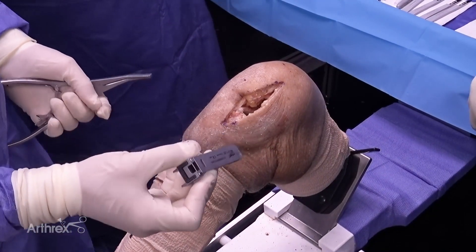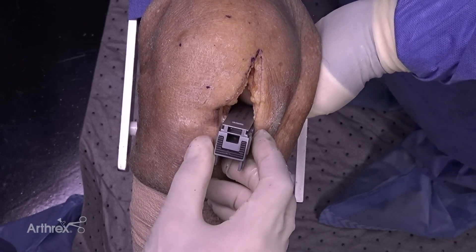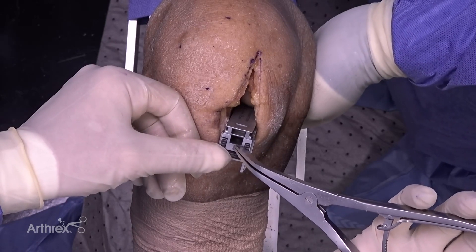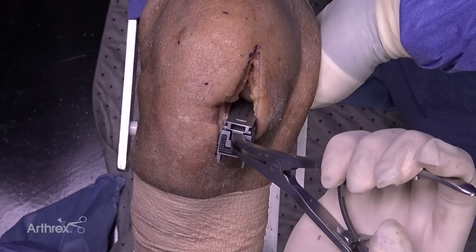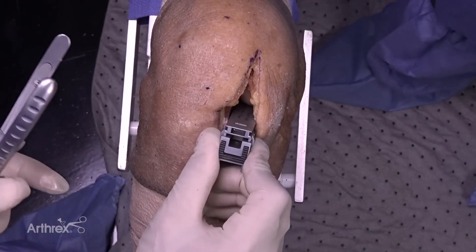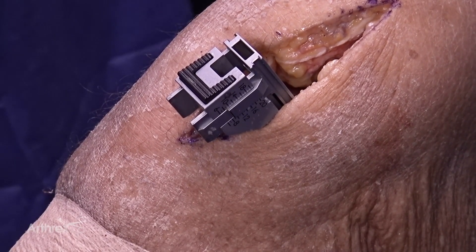Once we've made our tibial cut, we have now developed a space. We need to know what that space is and make sure it is adequate. We have an adjustable spacer guide here — simply place the end into the space. We have a laminar spreader that will help tension this correctly. This is a measuring device, not a device meant to gap open the space. Every click is analogous to one millimeter of space. It's now tensioned and in this space it's nine millimeters — we want a minimum of eight, so nine is right where we'd like to be.